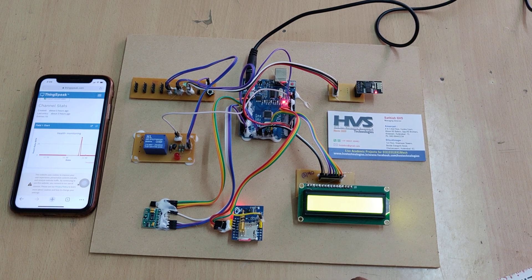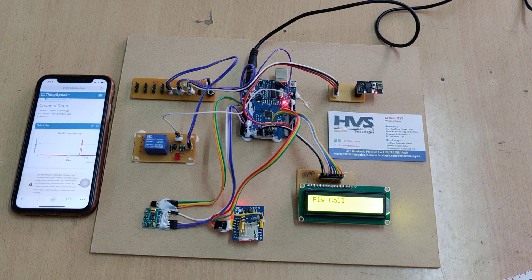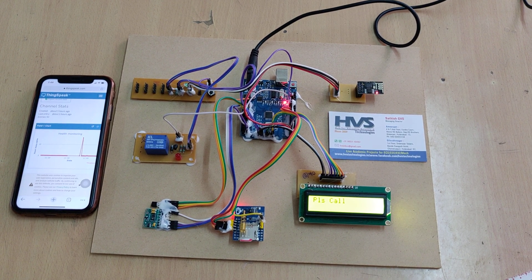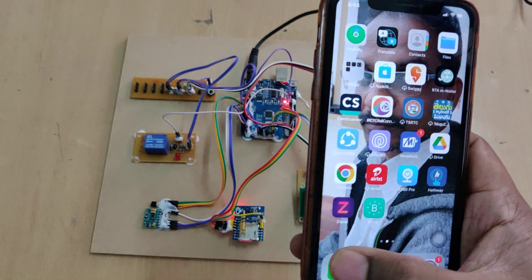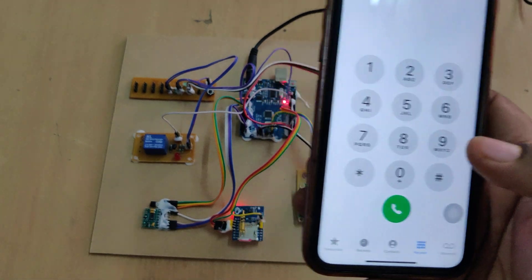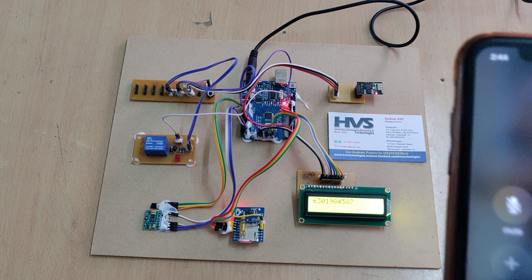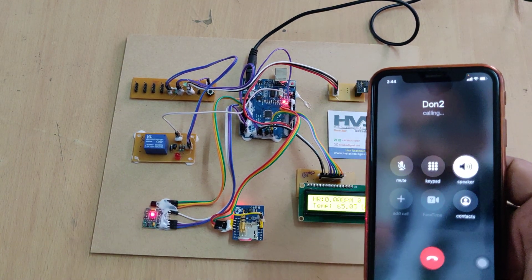The LCD will show when the network is found. For confirmation, you can call the SIM card inserted in the GSM modem — you will get a ring. Once you call, the number will be displayed and the system will automatically disconnect the call and store that number.